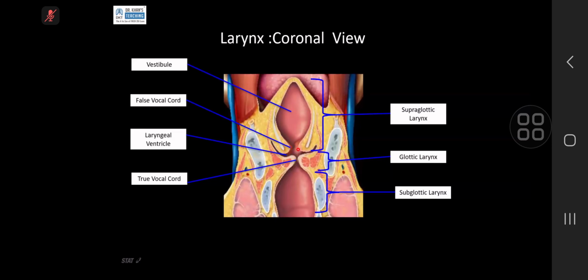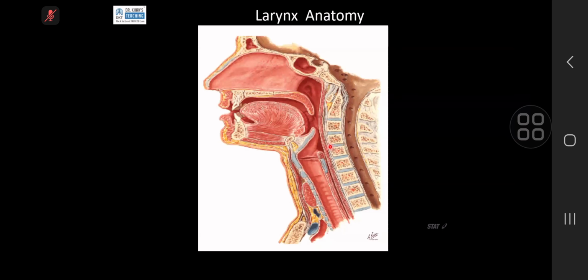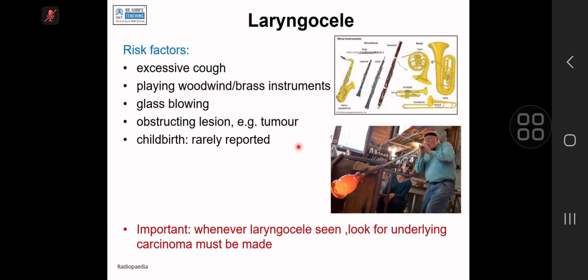Now, lateral to that are the laryngeal ventricles, right and left ventricle. Please remember, in an AP dimension there is an extension of the ventricle, a structure known as the saccule. This is the saccule we are talking about.